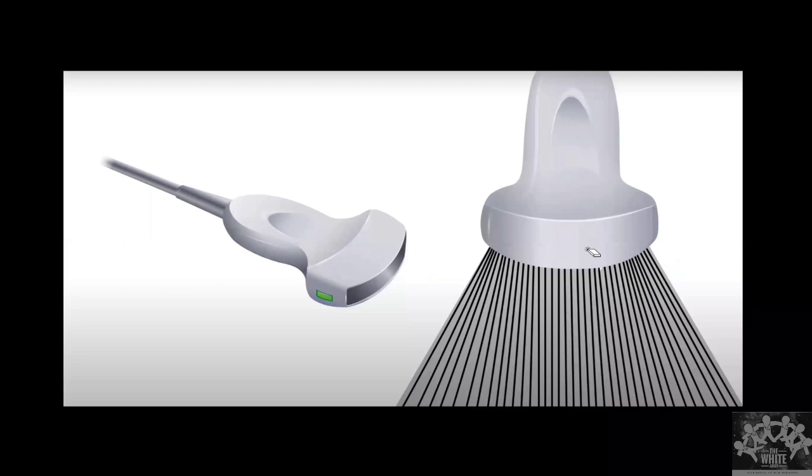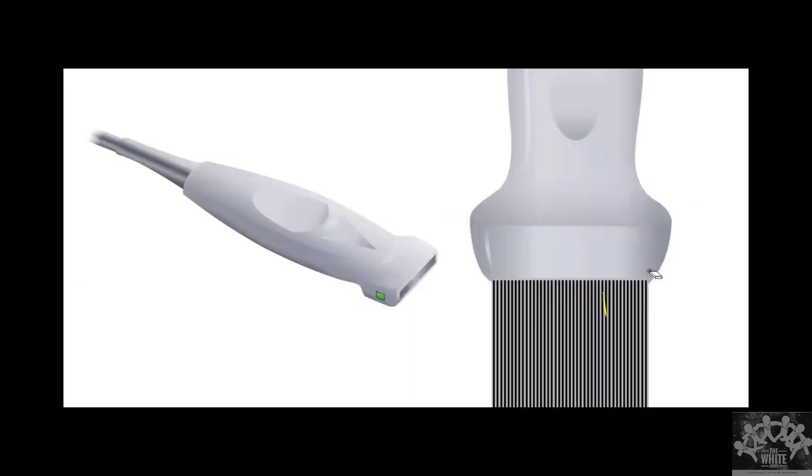So if you want to see a deeper structure, the first thing you have to do is select a curvilinear probe, not the linear probe. If you select a linear probe, we may not see the pouch of Douglas. In a regular ultrasound machine, there is no separate probe for pediatrics as such. We use a curvilinear probe and a linear probe.